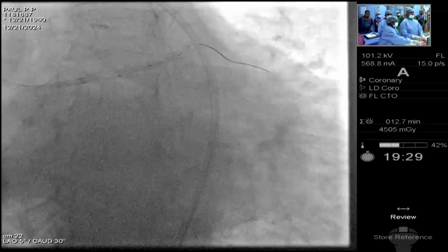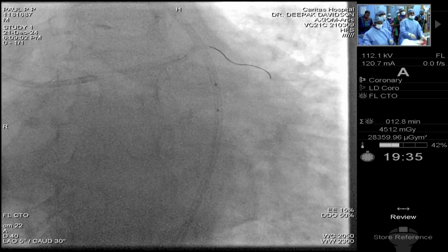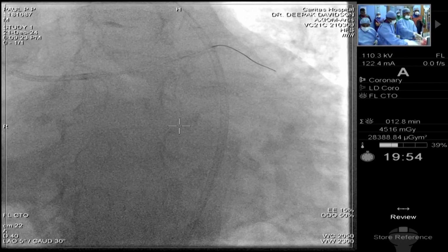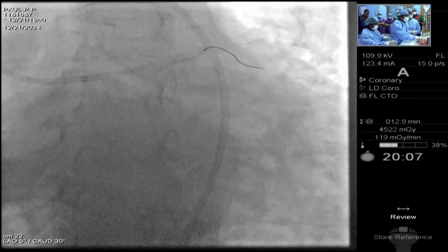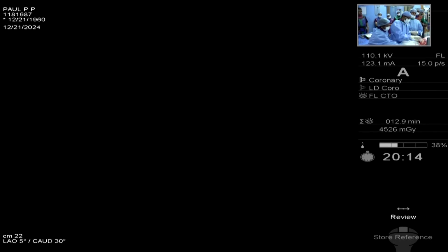I think we'll stop, do an OCT pullback. Some nitro. Can you come cranial?